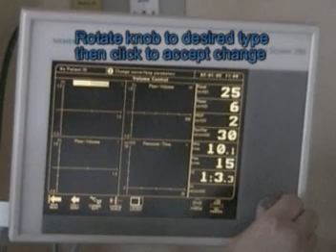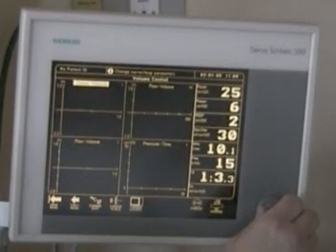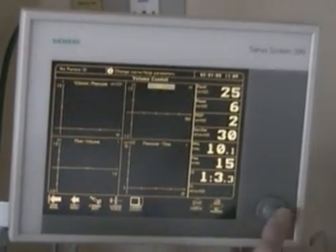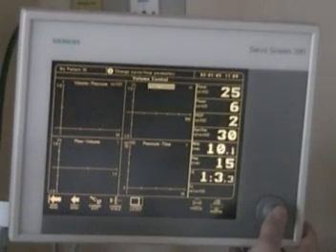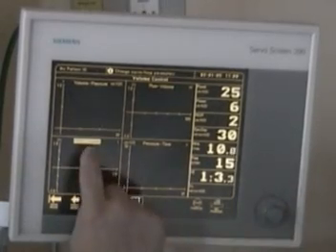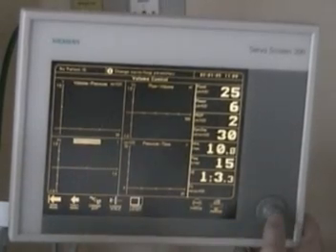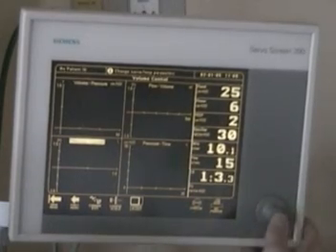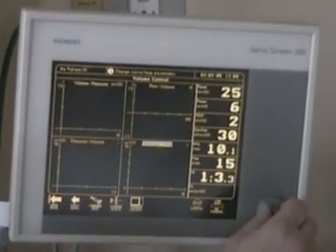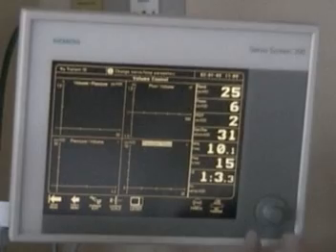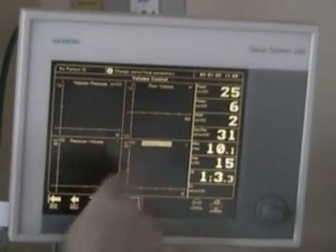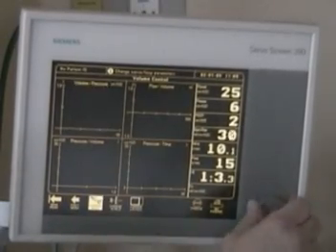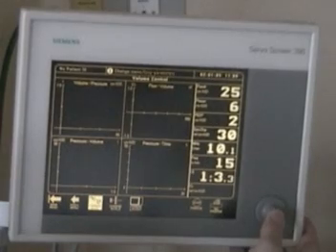Let's make this one volume-pressure. We'll leave this one as flow-volume loops, and we'll go down here and change that to pressure-volume. Over here we have pressure-time, so now we have four different loops. Let's exit the change.